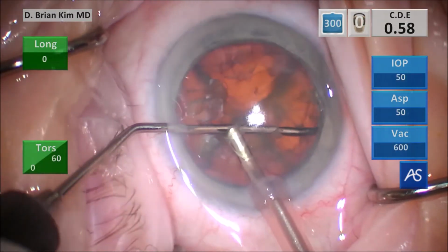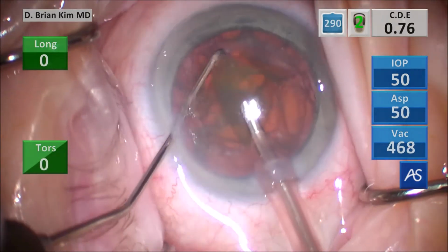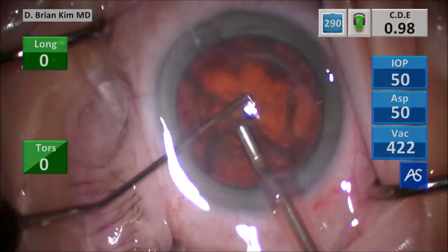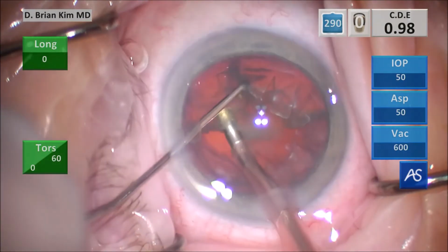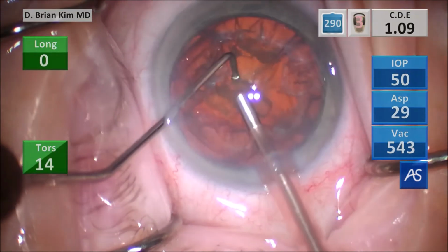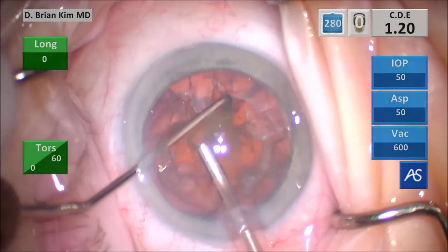Placing the chopper under the second quadrant, pulling it against the phaco tip and then crushing it. Lifting the pieces up, crushing it, and emulsifying the lens pieces. I always lead with the chopper because I know that as long as I'm under the rhexis edge, I'll be able to hook the lens piece up because of the length of the chopper tip. So I hook that last quadrant up out of the bag and then emulsify it.